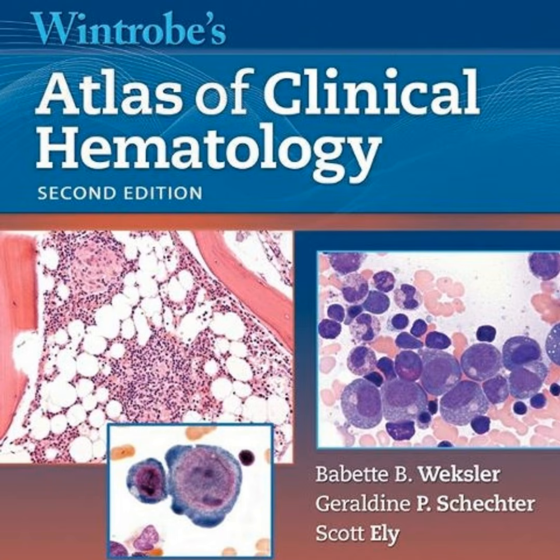Every patient journey really begins with a complete blood count, a CBC. That's from an automated analyzer. Right, the machine spits out the numbers. Exactly. But when that machine flags an abnormal parameter, say a high RDW or an anemia it can't explain, we have to go back to the smear. That slide is our first critical layer of information.